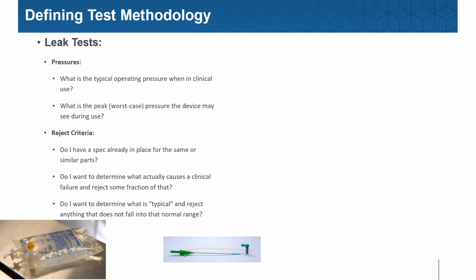Much easier to do that than trying to do independent testing with a pressure loss specification, where if you really want to find out what's leaking the same or reject what's leaking the same actual amount, you would have to do trials and experiments on each independent volume separately and come up with a new pressure change or pressure decay window of acceptability and reject. It's a lot more work in the long run. Yeah. It's a lot of work.